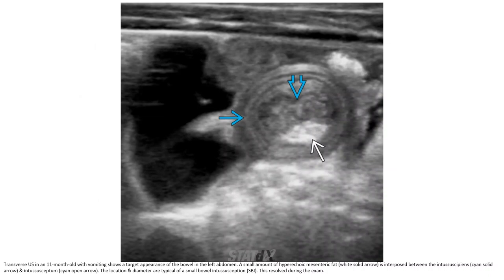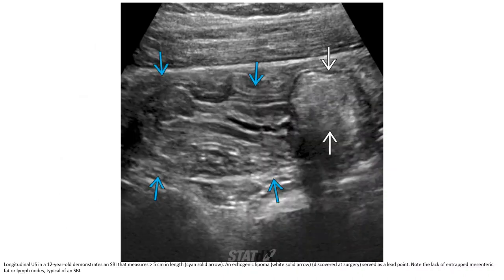On ultrasound in an 11-month-old with vomiting, a target appearance of the bowel is seen in the left abdomen. A small amount of hyperechoic mesentery wedge is interposed between the intussusceptum and intussuscipiens. The location and diameter are typical of a small bowel intussusception, which resolved during the study.